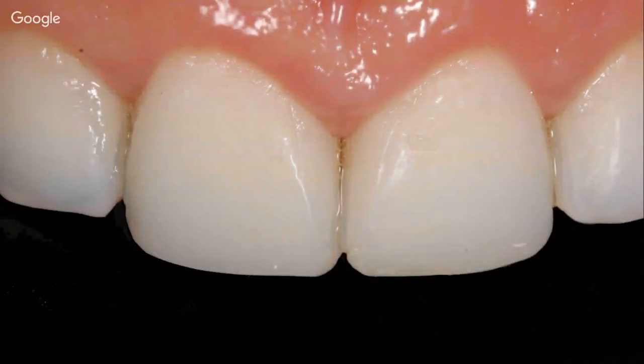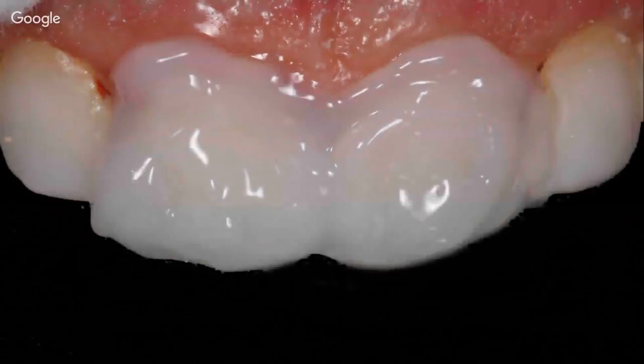The composite is then, of course, applied. Glycerin gel is applied on the final layer, and we light cure through glycerin gel to get rid of the oxygen inhibited layer. Now, again, you can avoid this step if you are doing lots of finishing and polishing at the end, because the oxygen inhibited layer is going to form on the surface of the teeth, and if you are going to polish and finish the teeth, it's going to be removed anyway. But it never hurts to perform this step just to make sure.